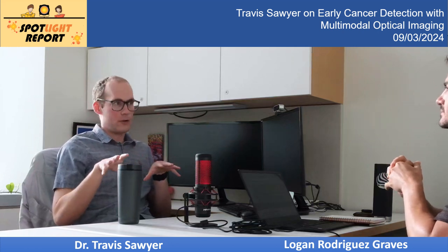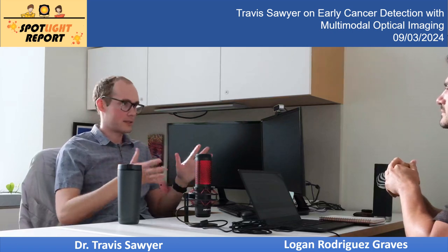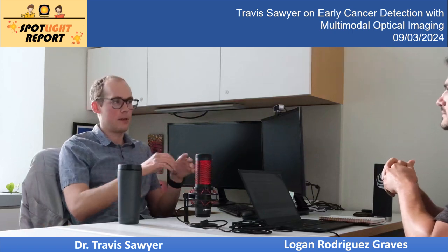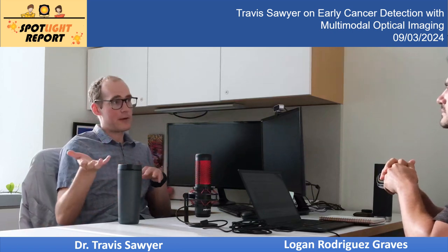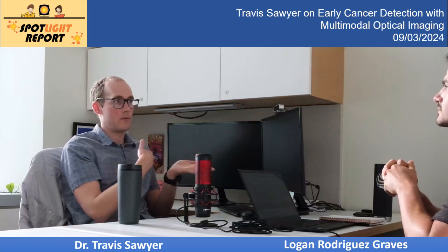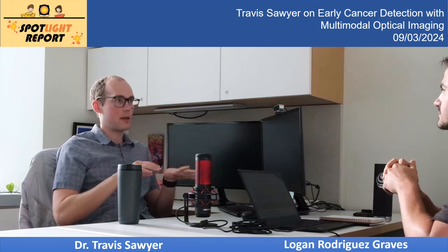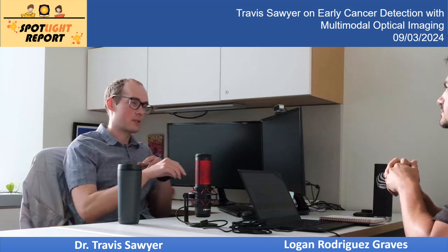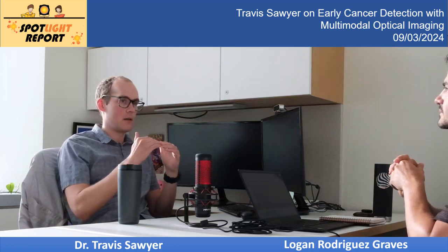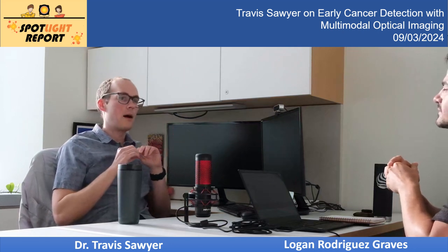The difference between standard fluorescence and multiphoton is that with multiphoton, you have two photons, so to speak, of a higher wavelength getting absorbed at the same time, approximately. And so you could have two 1,000 nanometer photons get absorbed and then produce the same fluorescence as a 500 nanometer photon. Yeah. And so the reason we like that, again, is the penetration depth thing, that if you use infrared light, it penetrates more deeply. And so you can access nice depth profiles, a couple hundred microns at least below the surface.